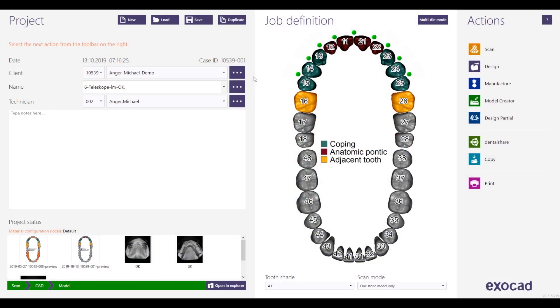Hello and welcome. My name is Michael Langer. In this video I would like to show you how to produce telescopic work with the framework in the pedestal area by using the attachment tool.